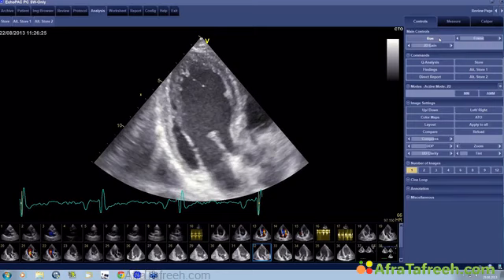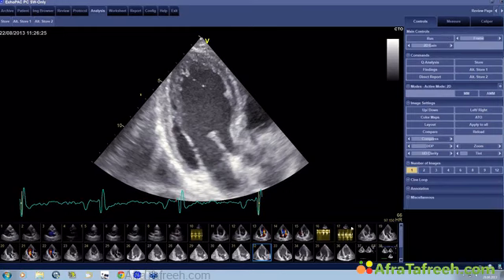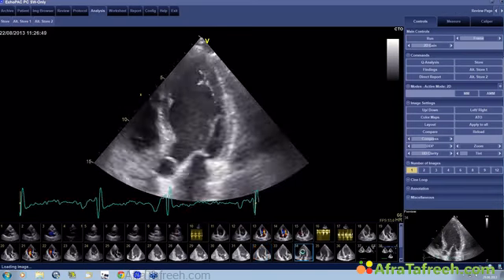Sometimes you can even make the diagnosis simply by looking at a still frame. And this might not be the classic example where you can do this, but very frequently you will see that there is a kind of distortion here or in the inferior wall or in the apical wall, and this also contributes to you making the diagnosis of wall motion abnormality.